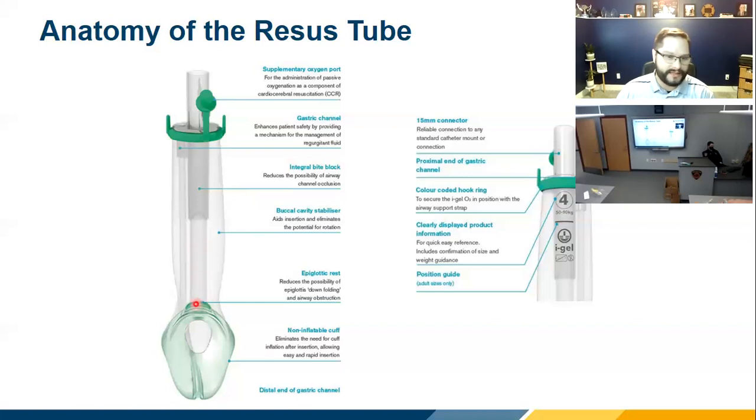As you move further down, there's a little extra flap — an epiglottic rest. When you insert the device, it holds the epiglottis up and out of the way so it doesn't flip over the glottic opening. It also helps seat the device where it belongs.